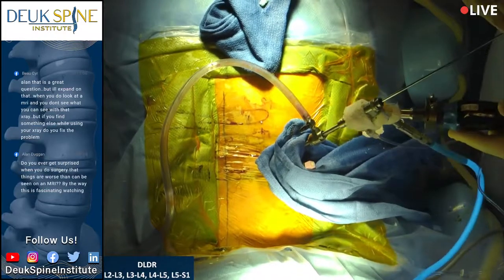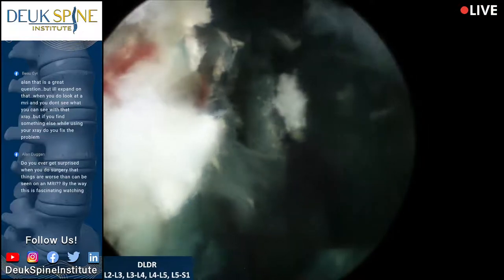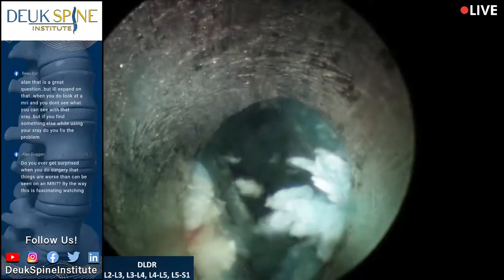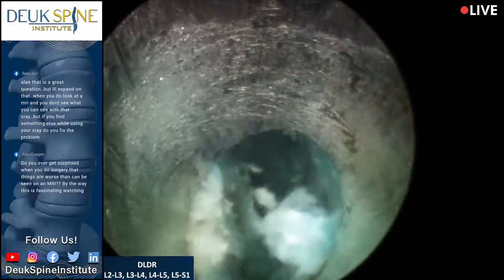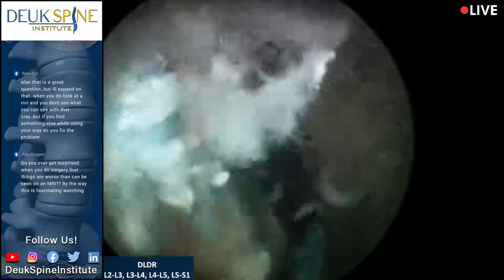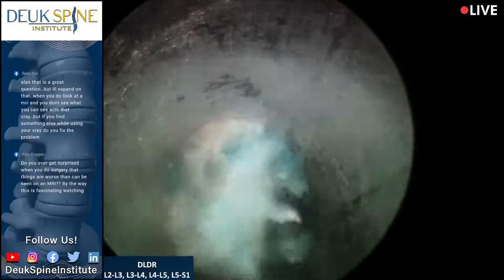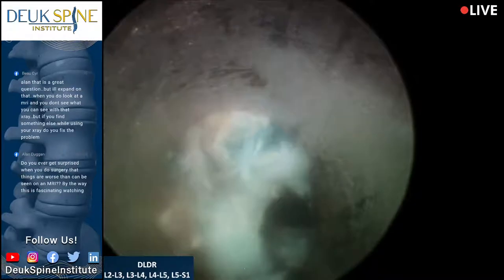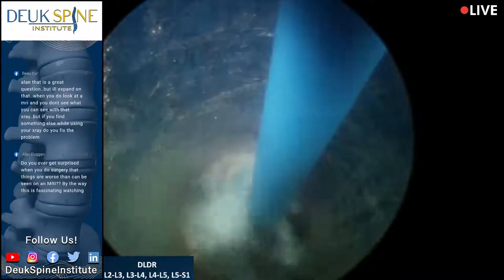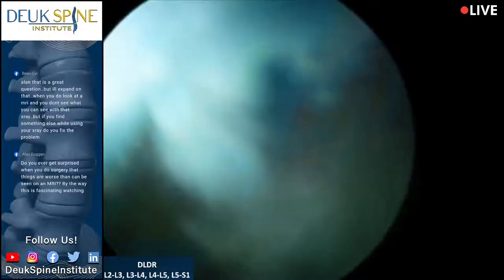All right, scope back on. All right, there it is, we're clear. So that was a big herniation that was sitting in the foramen that I shoved back into the disc, and now I'm cleaning out the rest of the tear. So I got a little bit of tear to debride here. How are we doing over there, guys? Good. I don't mind it being a little lighter to be safer. Whatever you need to do. I don't mind a little bit of moving.